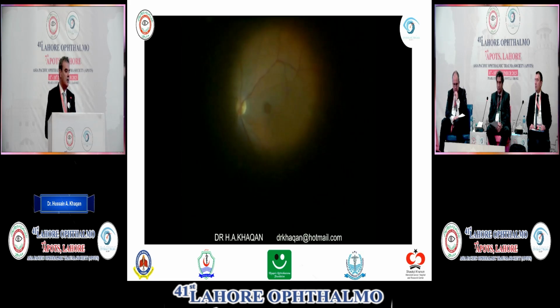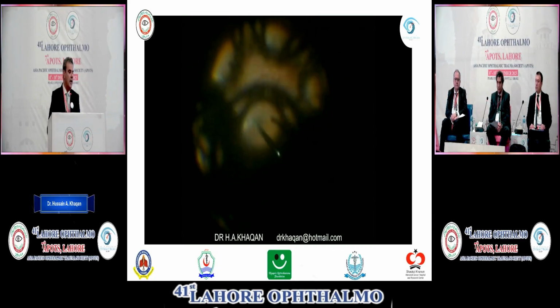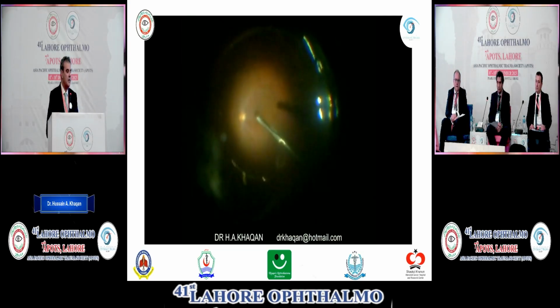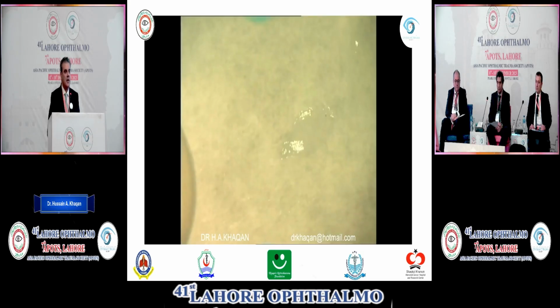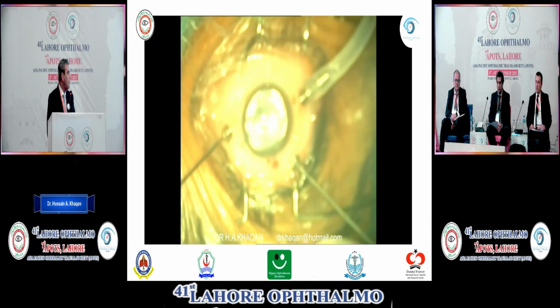So what next? My plan was to do an amniotic membrane graft. I prefer to do amniotic membrane graft in these cases, and I prefer to do it under the air. We have published this technique in Retina in 2022, and it is the largest series in the world published on this technique.